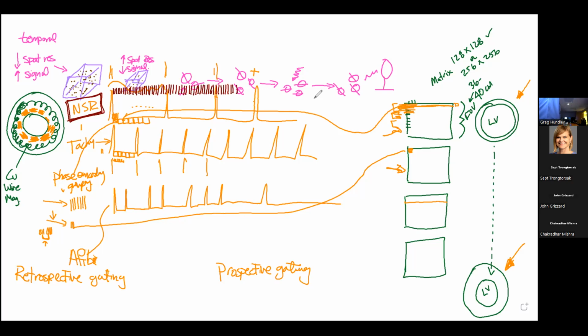Well, this is what it's doing. It's just running this entire line here. And it knows how many frames your movie is. It knows your temporal resolution. And so it's going to collect enough stuff over time to fill out all this movie stuff right over here on the right side. And then you'll notice when the scanner is running, very key up here are these trigger signals, and it is looking for something repetitive over time. It could be the QRS complex. It could be the T wave.